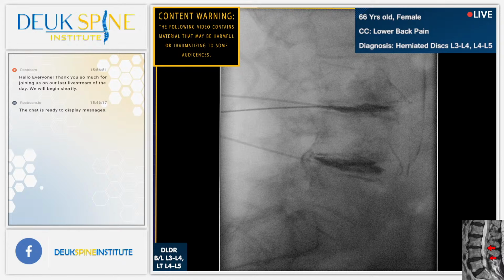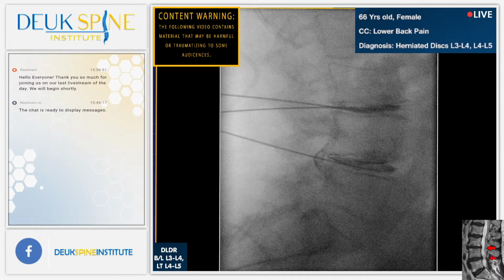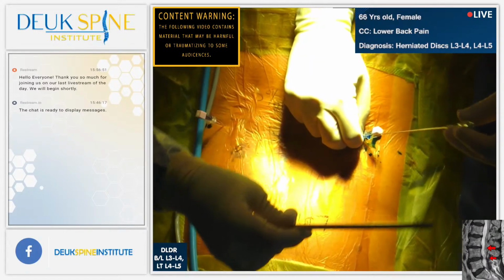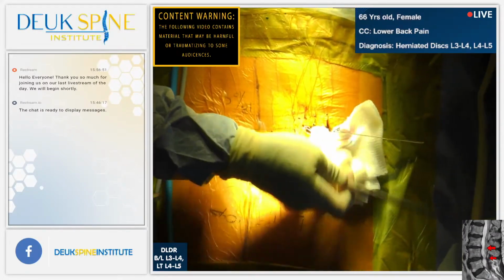Do you see that arch? How she arched up? I mean, you don't even need to get a verbal response these days. You just watch the arch, you know they're responding. That's painful. You know what I mean?